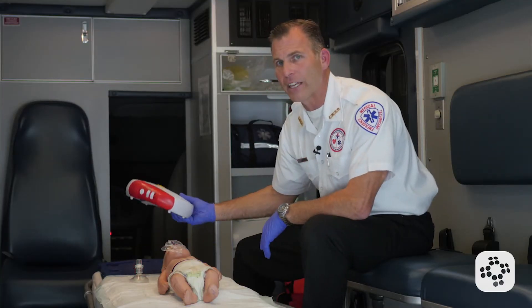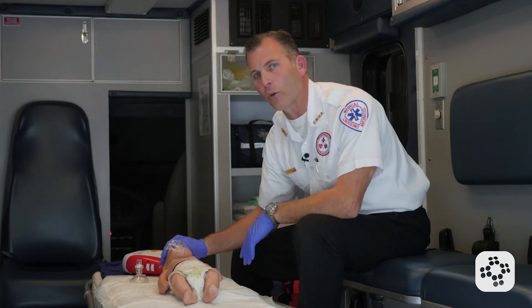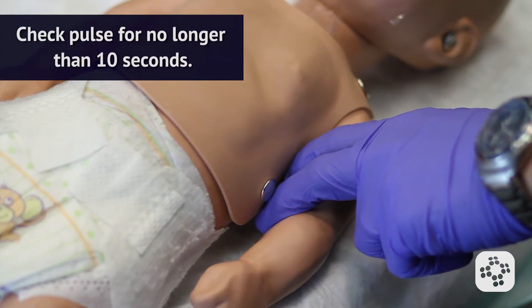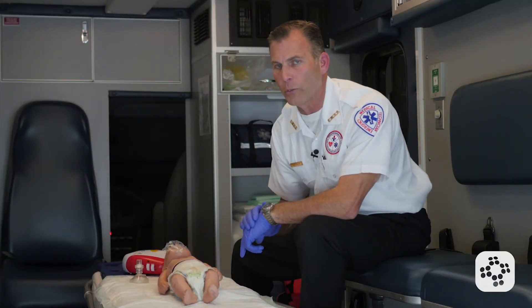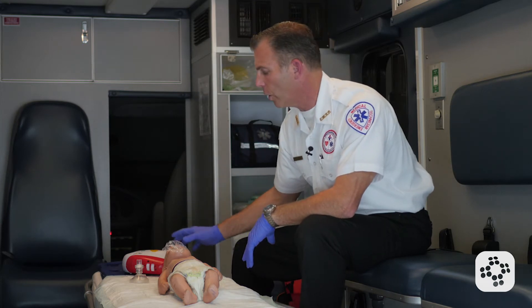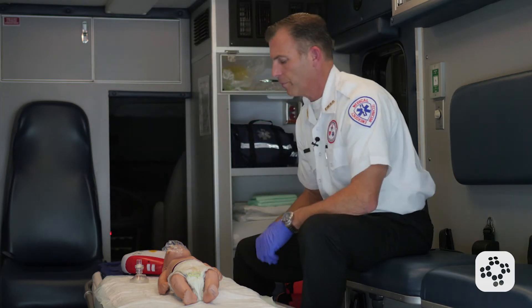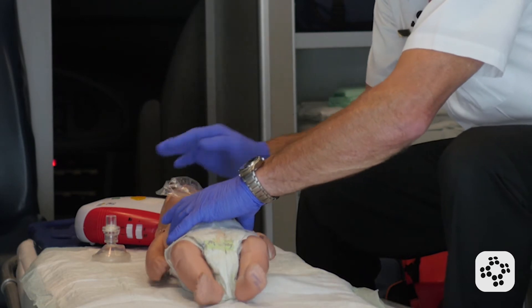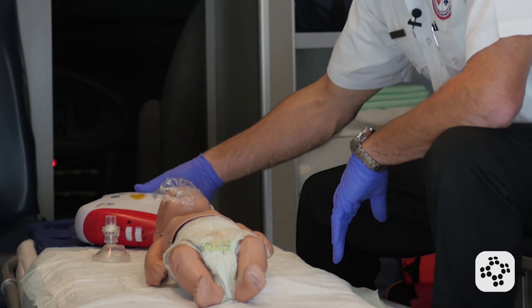In this case, we actually have an AED available. I'm going to assess the baby for breathing and normal breathing, and check for a pulse for no more than 10 seconds on the brachial artery. The baby does not have a pulse and is not breathing normally, so because I have an AED here, I'm going to go ahead and use it immediately by turning it on. I strip the clothing down over the chest and back to reveal both surfaces, dry it off if needed, and it's now prepared for the AED pads.